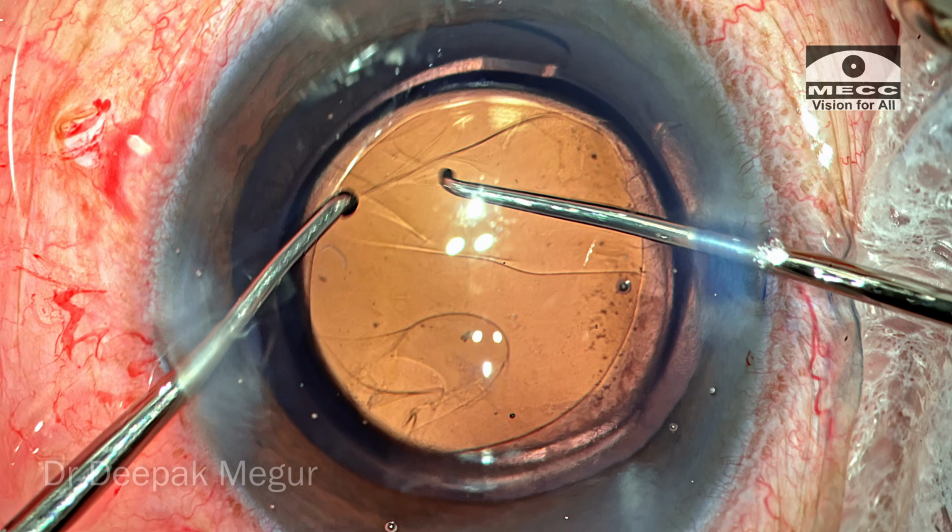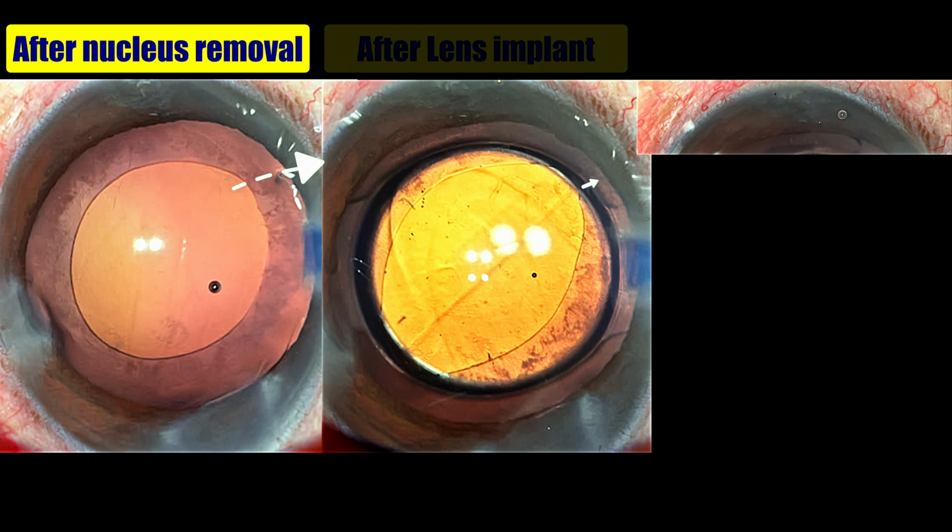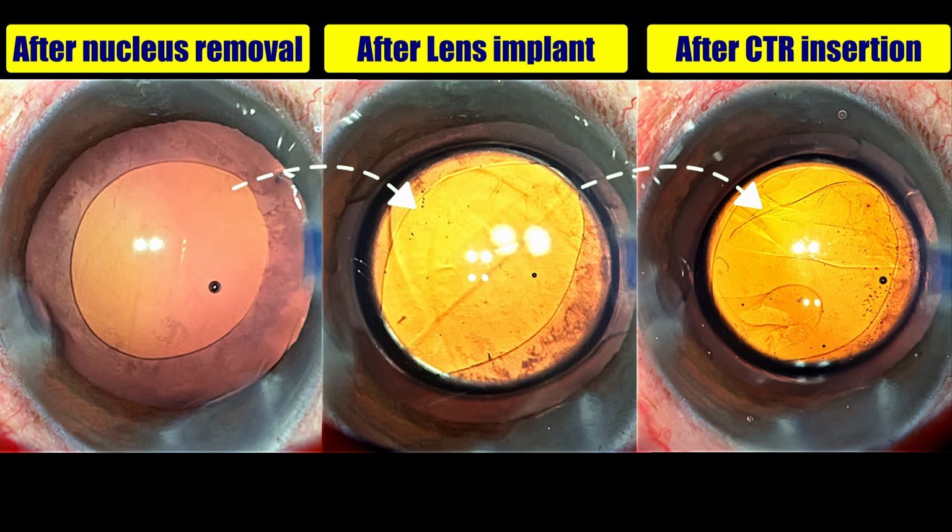And once the CTR has gone in, the shape of the rhexis again changes back. It becomes relatively more circular. It is not as circular as it was before, but still is definitely better than with just the lens inside.